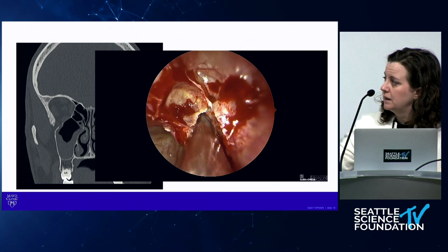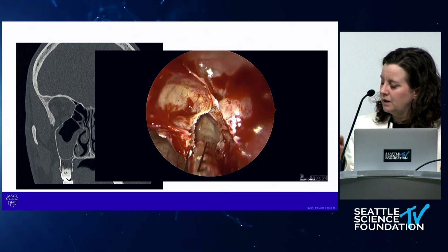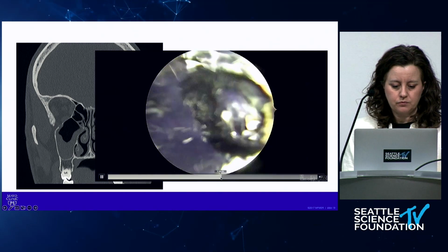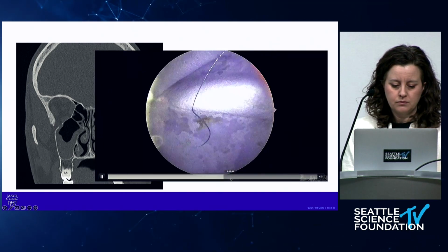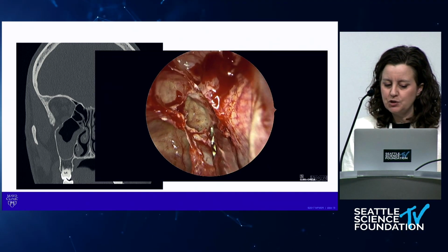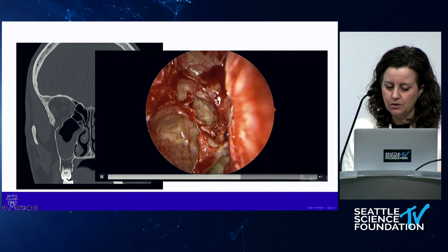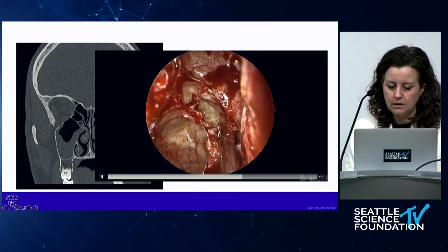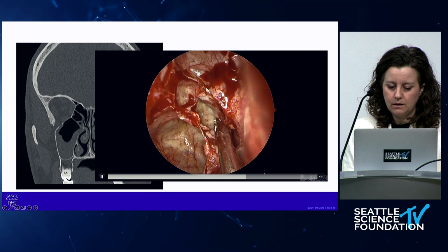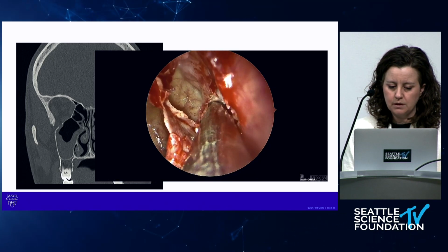Again, I can see my lamina. I'm not plunging that microdebrider in where I don't have good visualization. I've seen the superior turbinate. I can trim the bottom of it off. I tend to trim that lower third so I can start to see the sphenoid opening. And we'll get to that a little bit more. I'm opening up these posterior ethmoid cells.